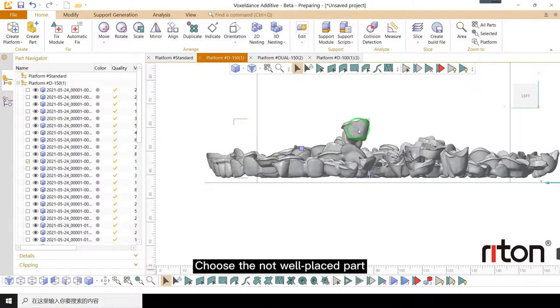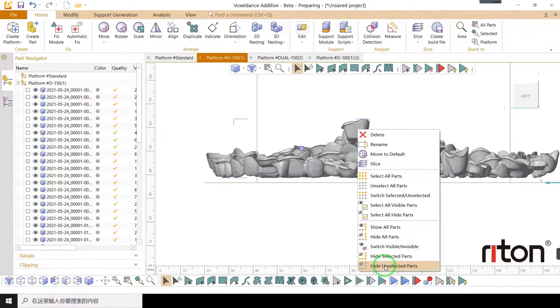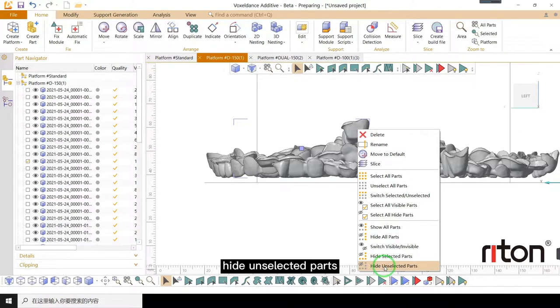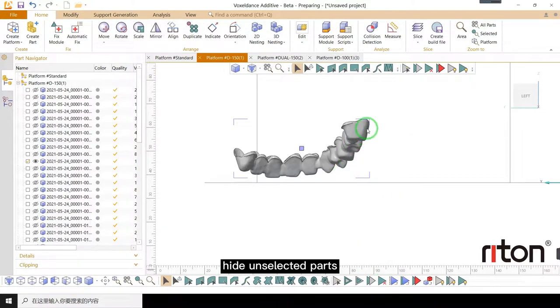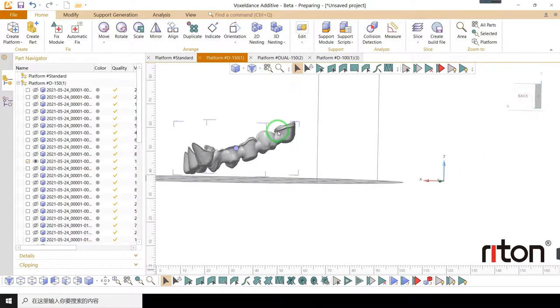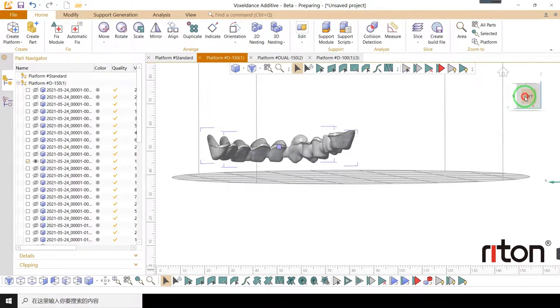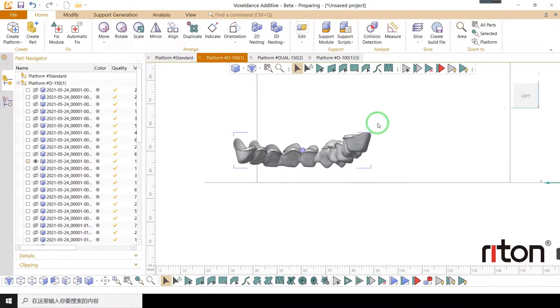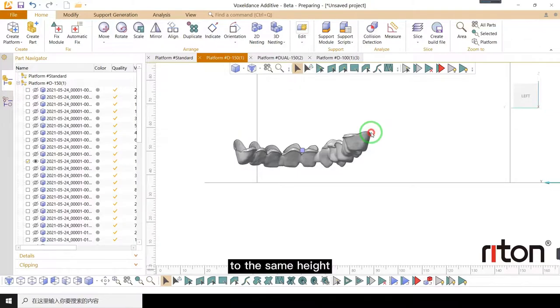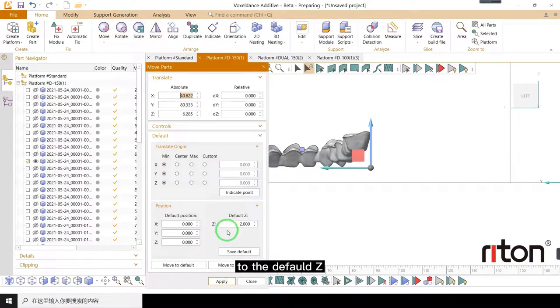Choose the not well placed part. Right click, hide unselected parts. Adjust it to the same height, then move it to the default Z.